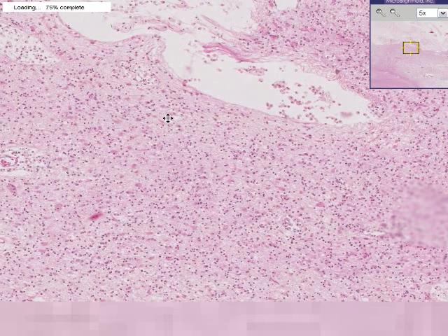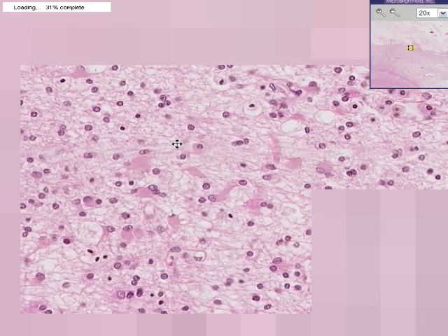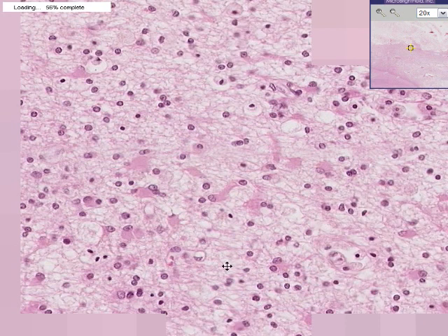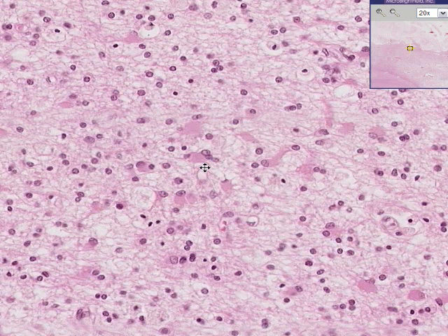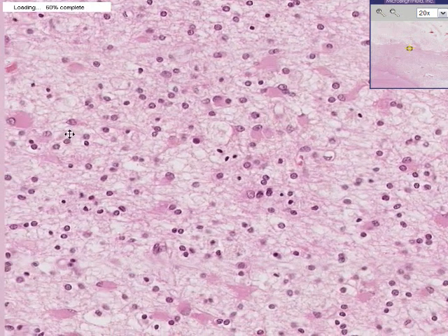Well, let's go a little bit further towards the bottom and I think I want to at least convince you that this is brain tissue. And I think you could see a whole lot of glial cells here, much more than there should normally be. I don't see any neurons yet.